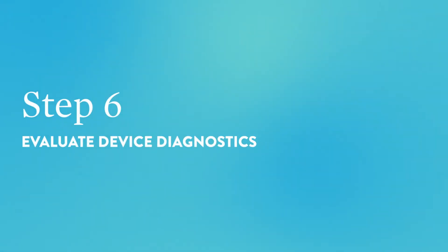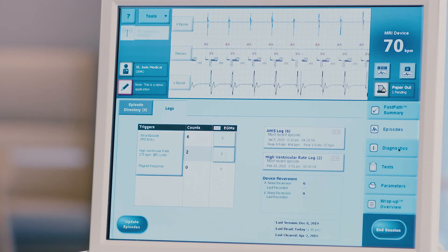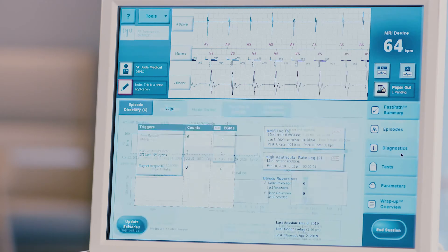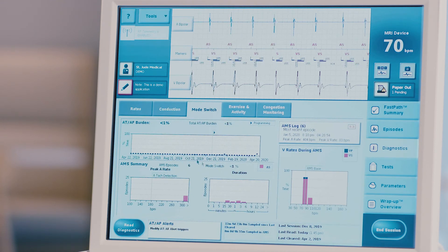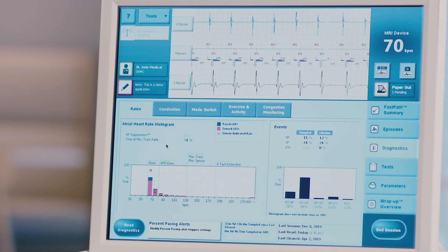Step 6: Evaluate device diagnostics. Press the diagnostics tab on the right hand side of the screen. The rates tab will appear first. Evaluate the atrial heart rate histogram.